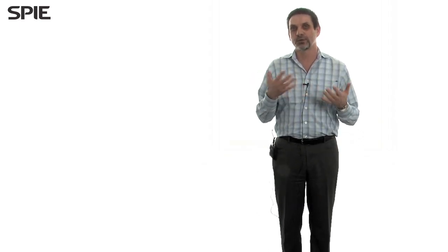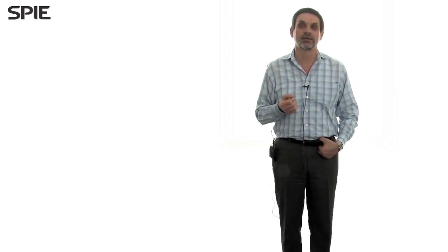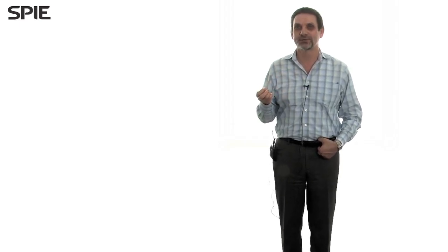But goggles like that don't exist, so we also work on development of pulsed near-infrared goggles with high enough brightness. And by the way, the same version of goggles with visible light will be used for optogenetic activation of the retina. It's another approach for restoration of sight. They also need very bright pulsed light in the visible part of the spectrum. So this product of goggles for activation of artificial sight is dual purpose. In terms of goggles, since Google popularized the concept of visual goggles with their Google Glass, it's very easy for us to explain now what we are doing. We can just say that it's a Google Glass for the blind.